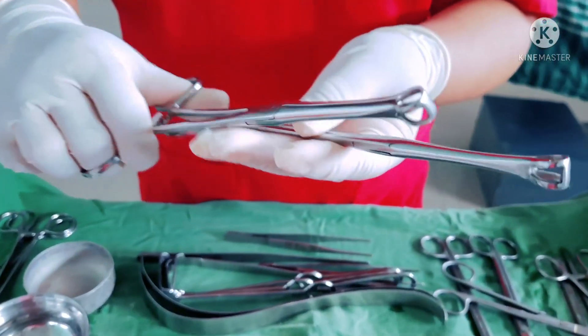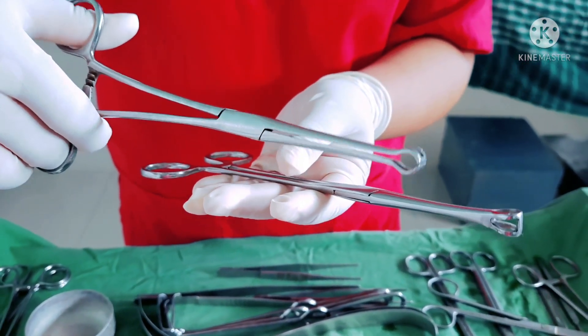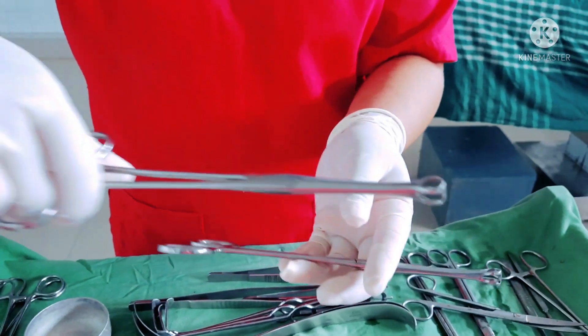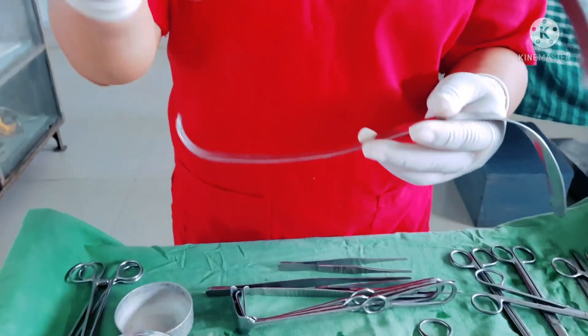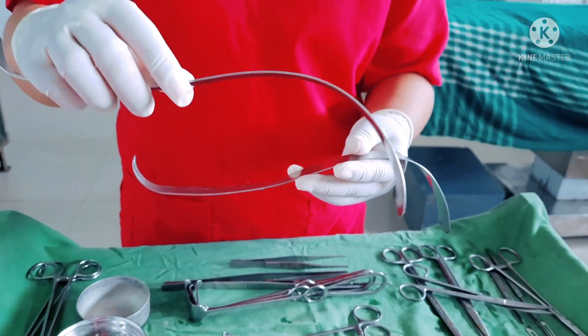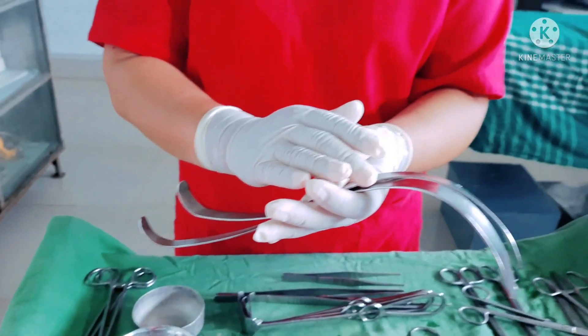This is a Babcock forceps, used to grab or hold the appendix during the appendix operation. In appendectomy, diverse retractors — smaller ones — are used for retracting the peritoneum wall to visualize the appendix properly.